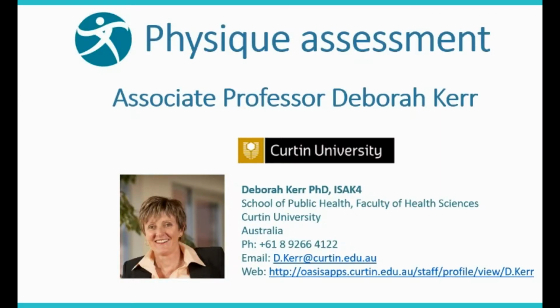Associate Professor Deborah Kerr. So ultrasound is really useful. It's a new technique that's been evolving. One of the advantages of ultrasound is it gives us an uncompressed layer of adipose tissue, as opposed to skin folds, which is a double layer of compressed adipose tissue and skin. So this compressibility factor we find varies from person to person.